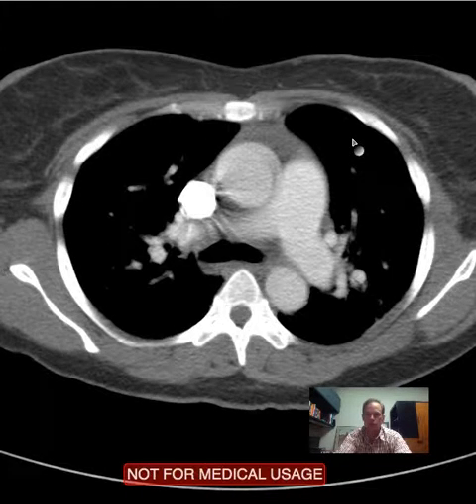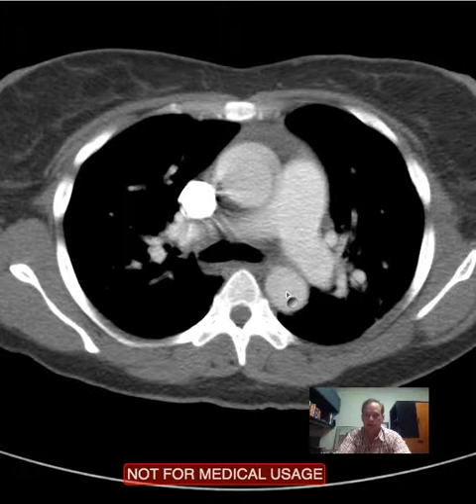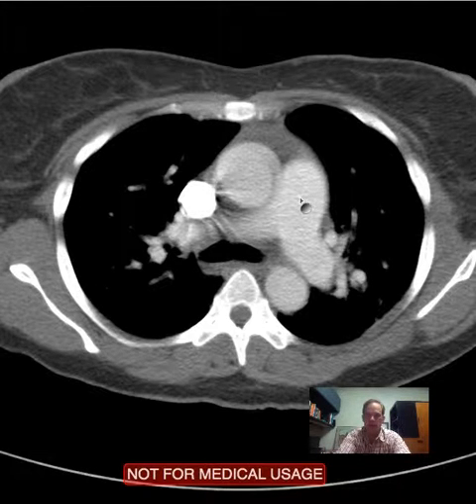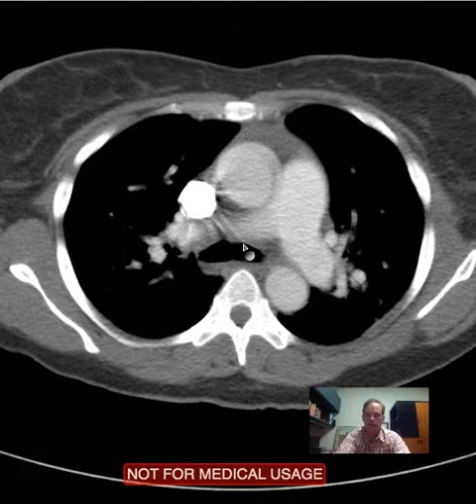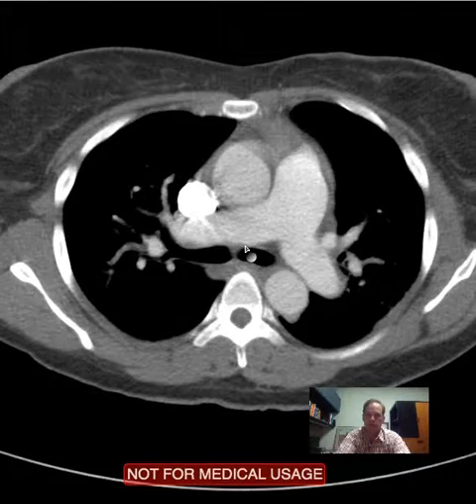Now we go up to the superior mediastinum. We see ascending aorta, descending aorta, main pulmonary artery with left and right main pulmonary arteries.